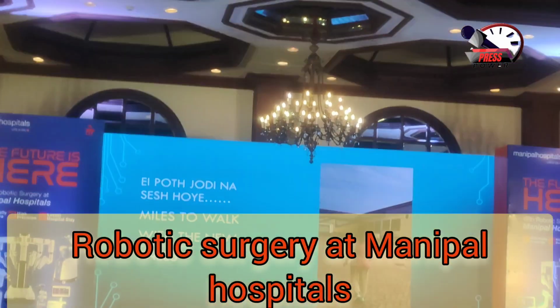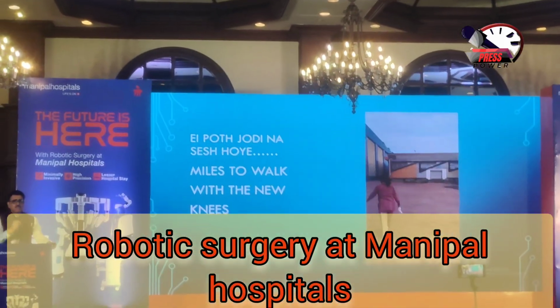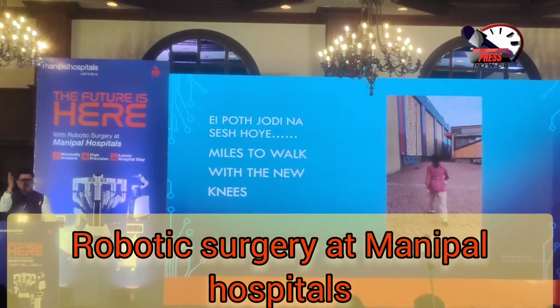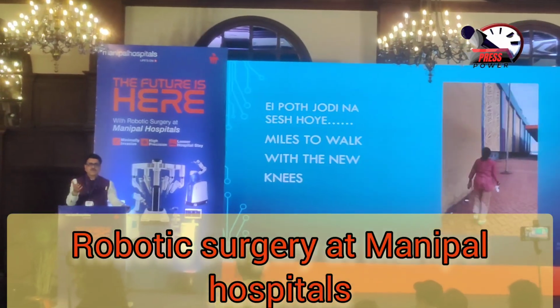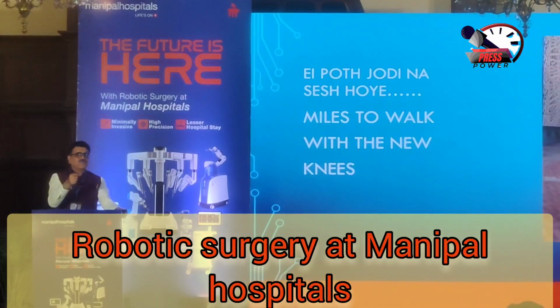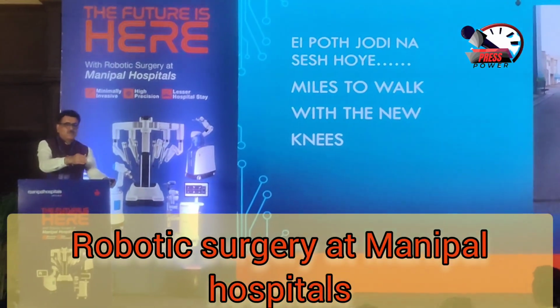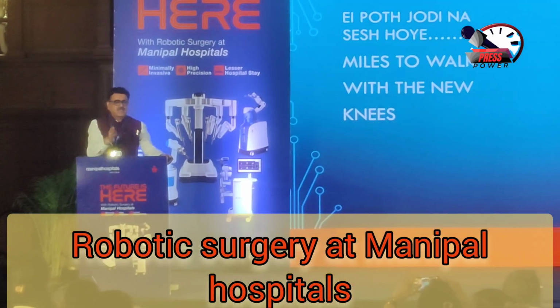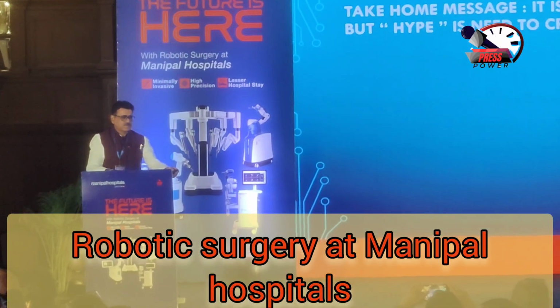So people living in Sikkim and Darjeeling, they come down because they have the places where they want to go. And the precision of 2 millimeters makes a difference. And that is what we can define with the technology which you have available. So technology improves you. It cannot replace the human hand and brain. Human hand and brain is there to feed the technology with information. Technology is there to correct the human hand and brain, which is actually going to give you consistently good results. And that is what the synergy of human hand and robotics is all about.